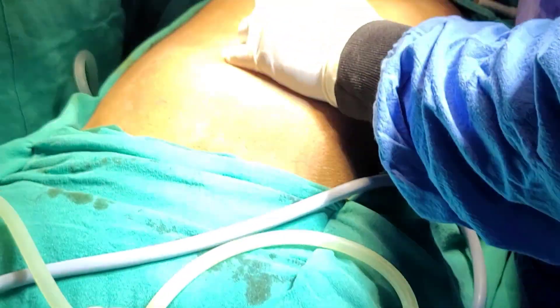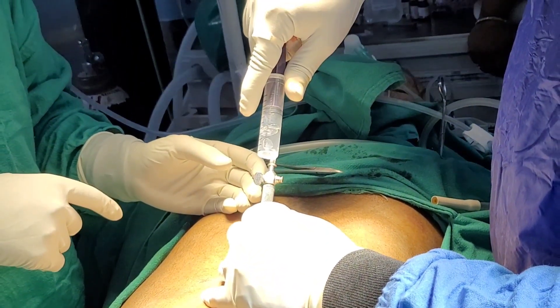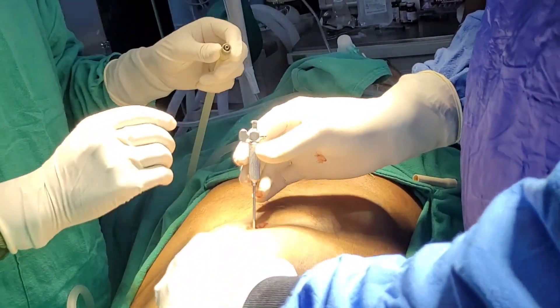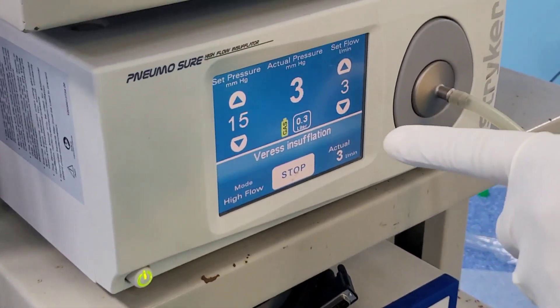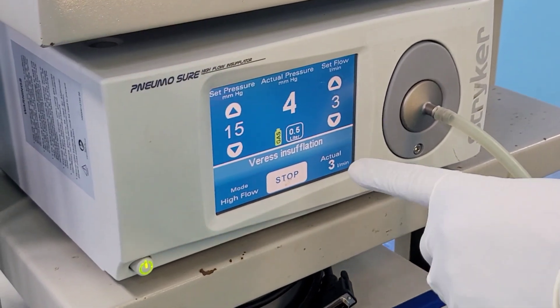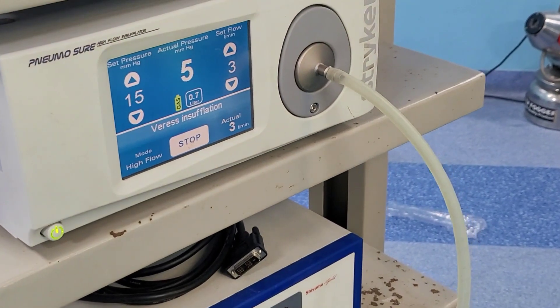How do you confirm you are inside the abdomen? This is irrigation, this is aspiration — you can see that since it has gone into a cavity, nothing but air bubbles are coming out. Then there is a hanging drop test — the drop is taken in. Now we connect the gas. The set pressure is 15, the actual pressure is three, now it is four. The set flow is three, and the machine has detected it is a very good insufflation.